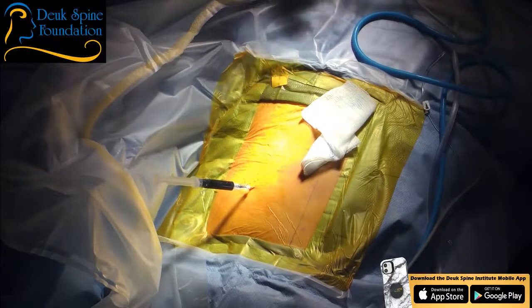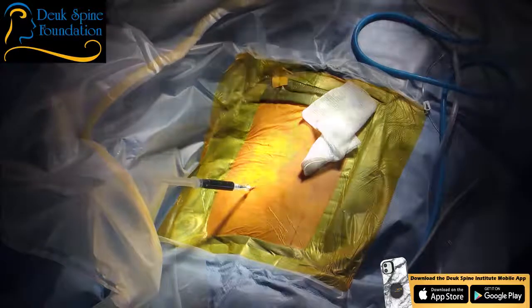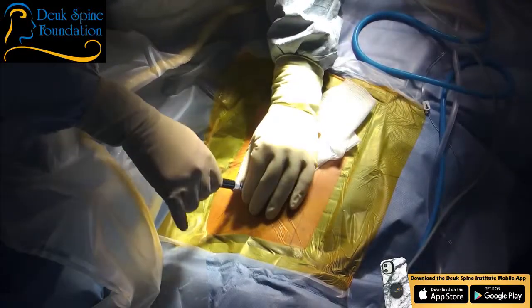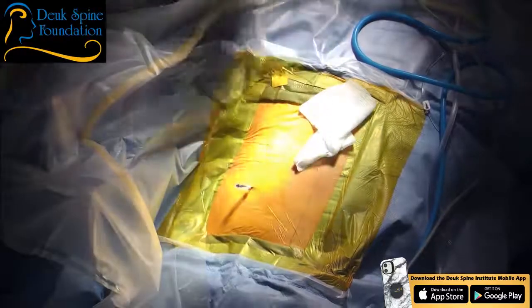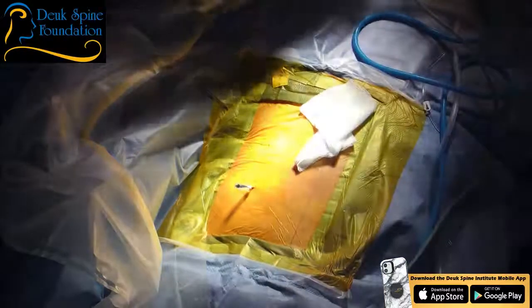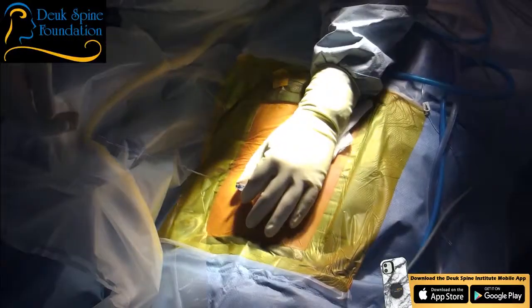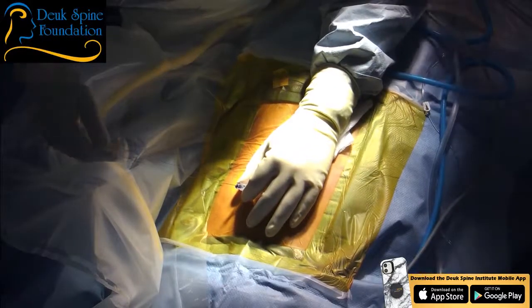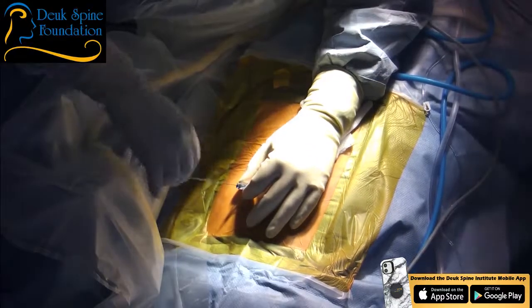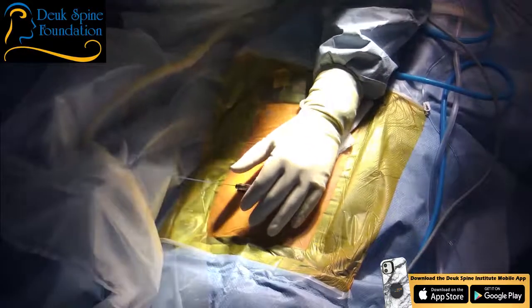I think he's going to need L4-5 done too, but he only wanted to do one level today. So we're going to get some of his pain gone. You can keep him awake, and this is where we're just going to have to figure it out, right? All right, let us know if it's uncomfortable for you, okay? You might feel a little discomfort. That's normal. Shot.